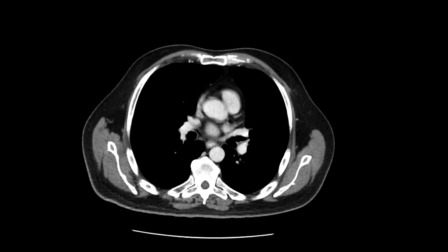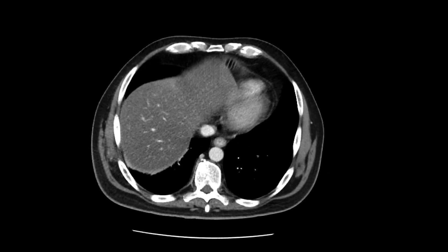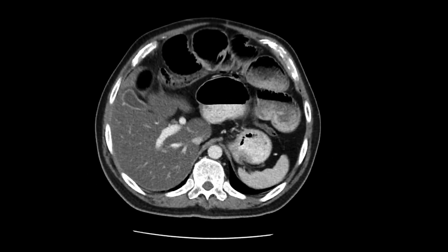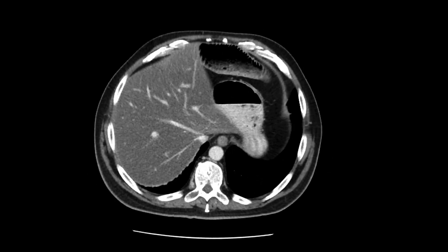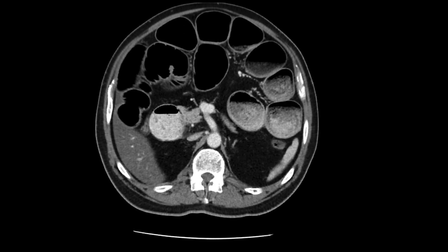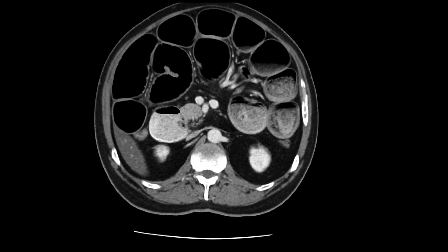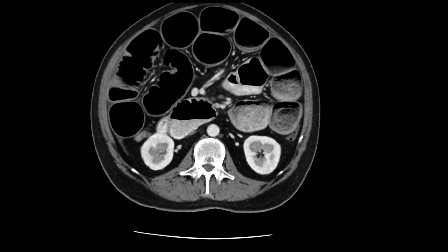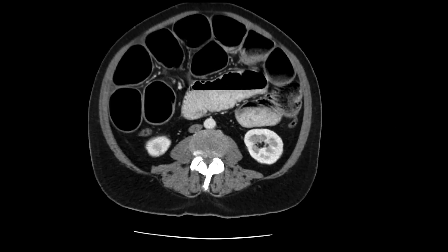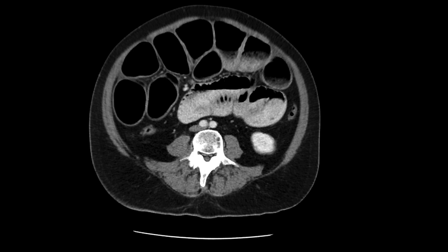This is a patient who comes in with abdominal pain, nausea, and vomiting. We've got a CT scan with intravenous contrast. You can see there's a whole bunch of dilated small bowel loops in the abdomen and pelvis, very, very distended. And as you go, you can actually see on some of these images that the large bowel, ascending colon, descending colon, all decompress. So we're dealing really with a bowel obstruction.